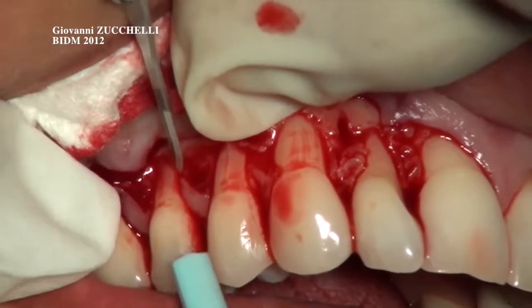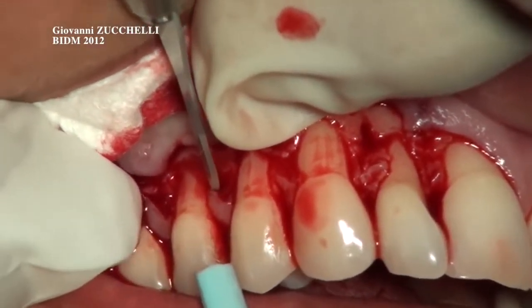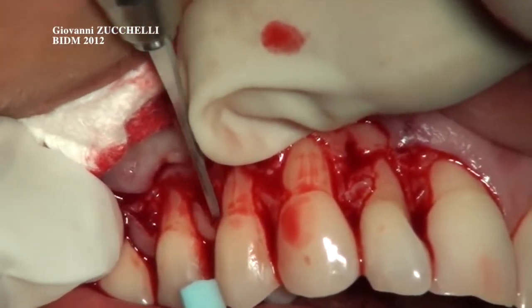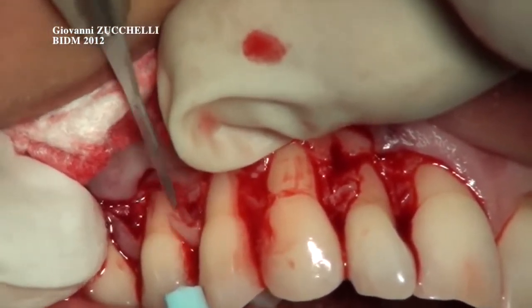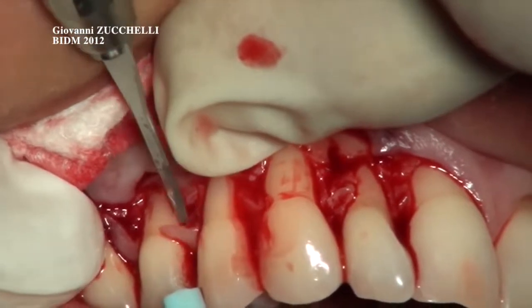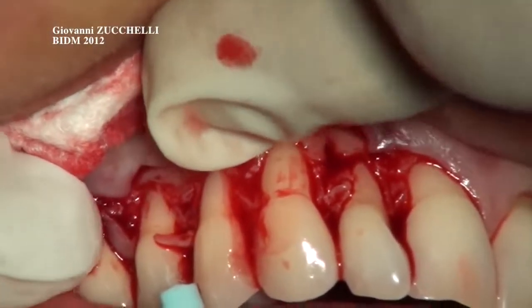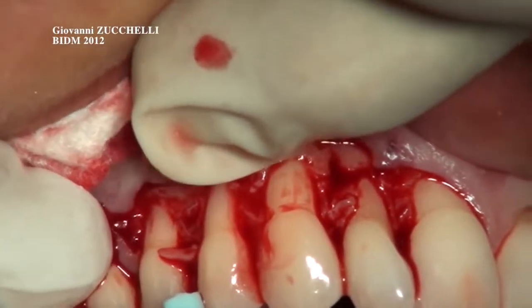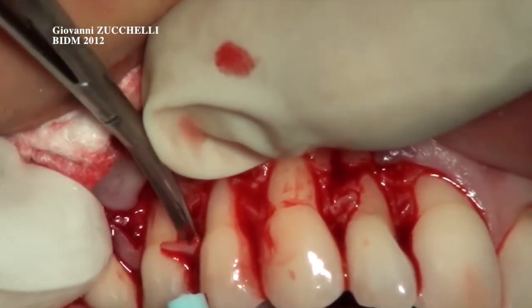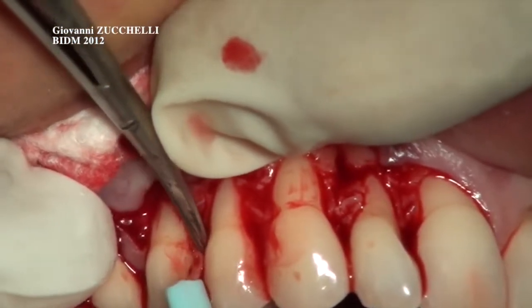I follow the first incision sign. This epithelium now is ready to be removed with a small scissor by following the same line.